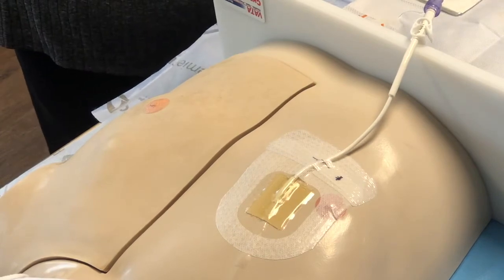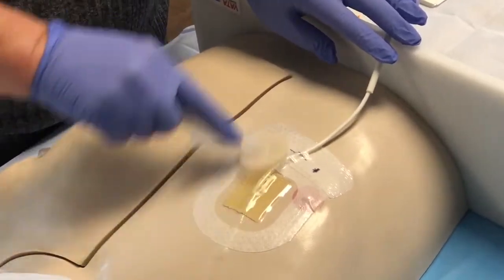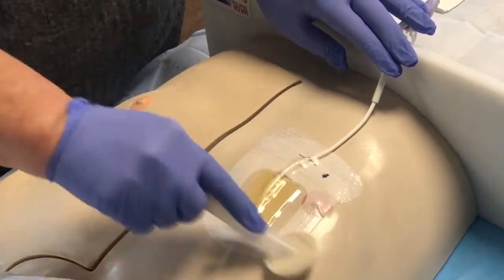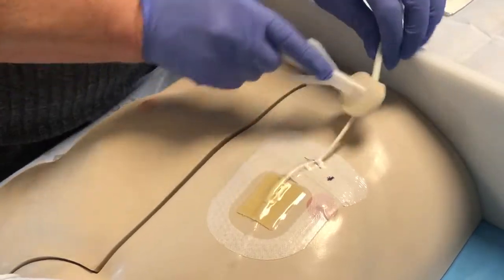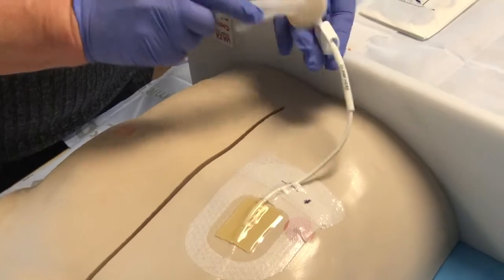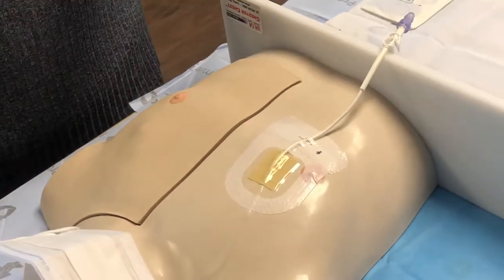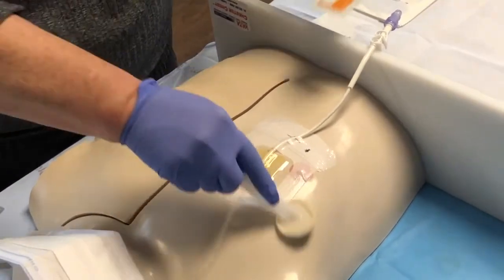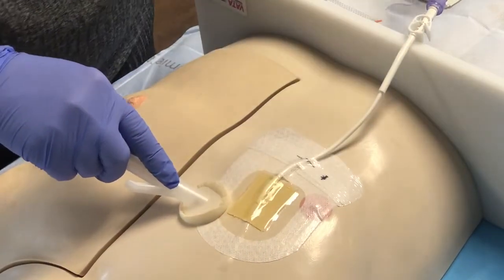Open the extra chlorhexidine cleansing swab and use it to clean the outside of the dressing and external length of the catheter using a scrubbing motion. This is to reduce the amount of bacteria and soil before removing the dressing. The chlorhexidine swab may also assist with loosening the adhesive on the dressing. If you need to, you can use the alcohol wipe in the kit to assist with loosening the dressing.